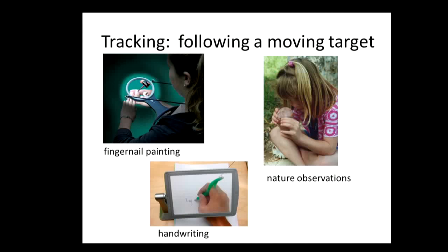In the bottom left, practicing handwriting under a magnifier, especially with all the variety of forms that are out there, it's important that students develop the skill. Not everything is able to be completed on the computer, and when students are out there in public, you want them to be able to have this skill down and be able to do it smoothly. In the photo on the right, a student is tracking a bug that's moving, and for some students this is just a very appealing activity.